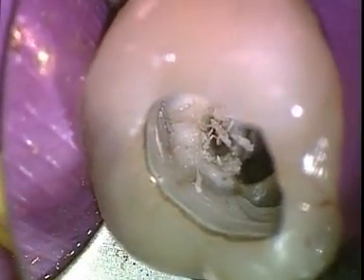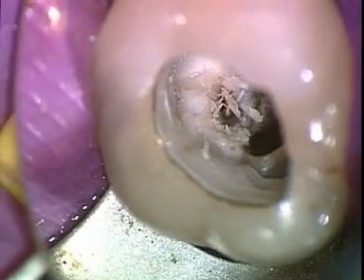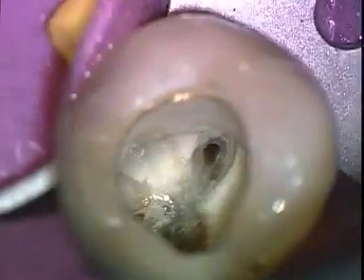All canal openings are enlarged with the intro file. It saves time because it replaces several Gates reamers. Initial canal enlargement enables infected pulp tissue and dentin to be removed, thereby preventing debris from being pressed into the para-apical region.